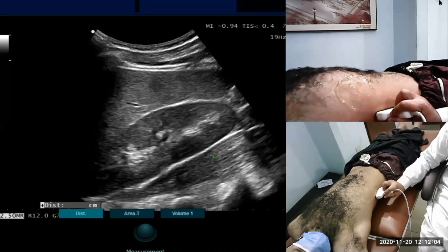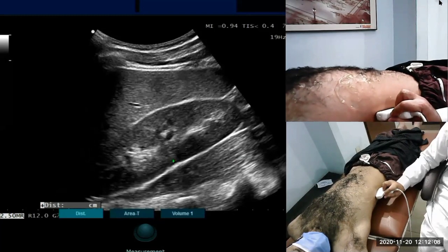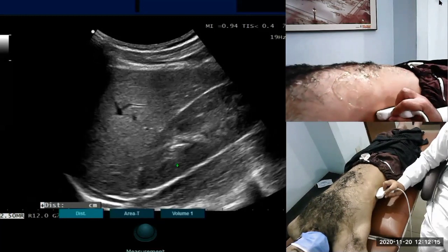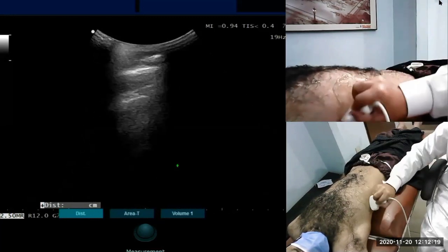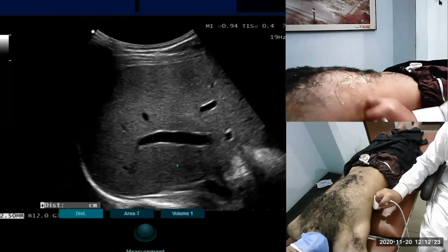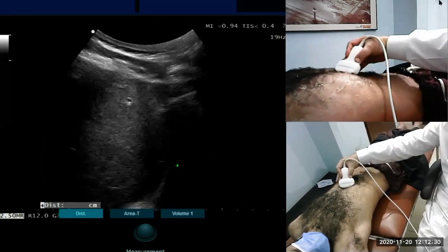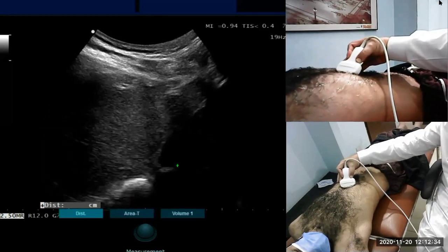So this is the psoas muscle, which is stationary and it is sliding over it. There you see the kidney sliding over it. I have seen through the intercostal spaces the liver, and now this very important place along the right costal margin in the epigastrium.